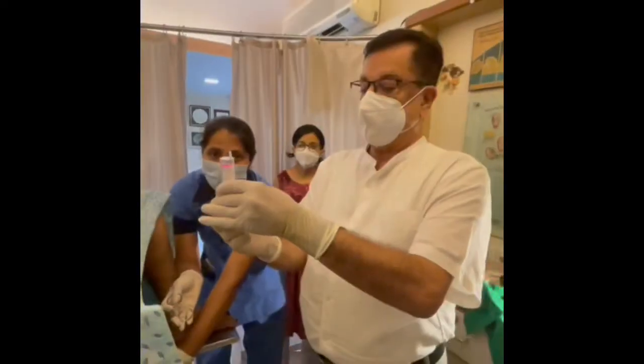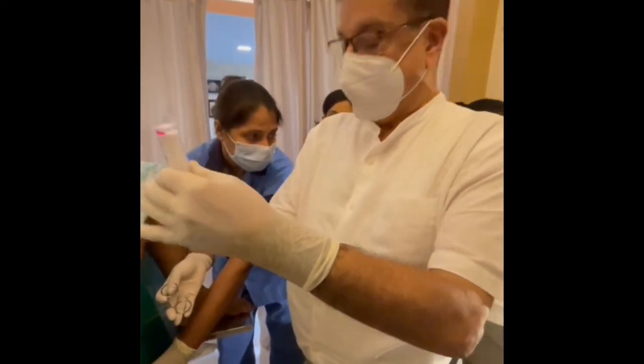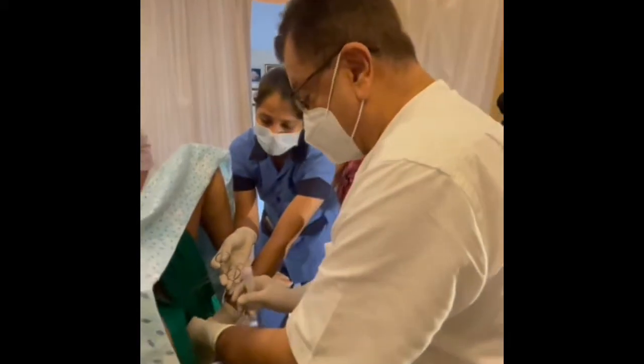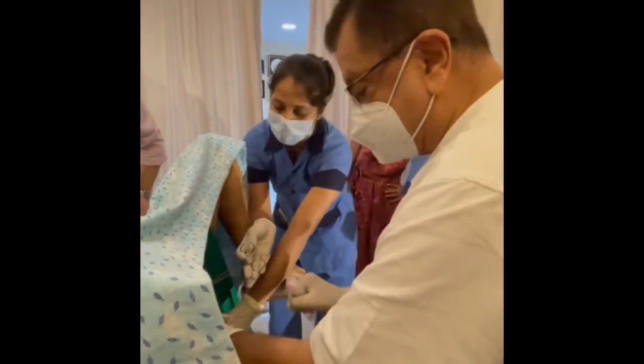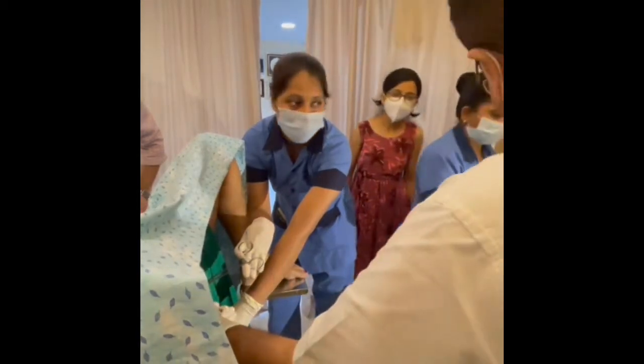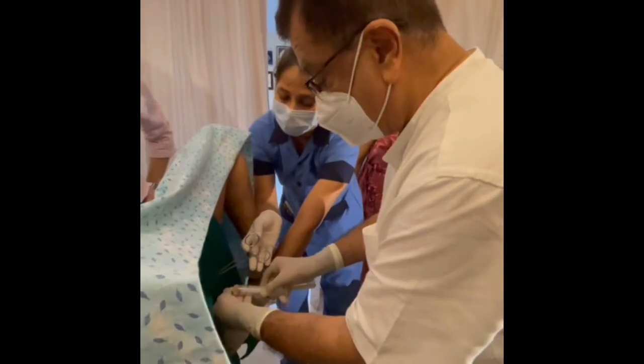Take the syringe and you should take some culture media in it. After that, you should take out the stilet and fix it to the syringe.